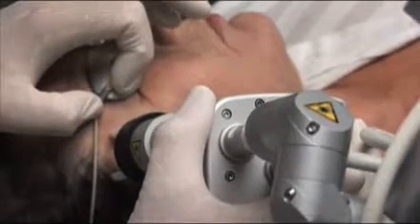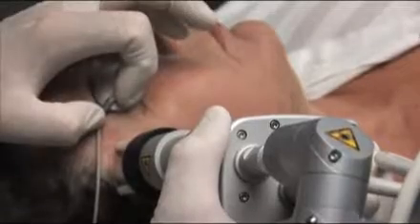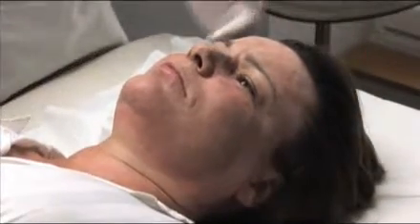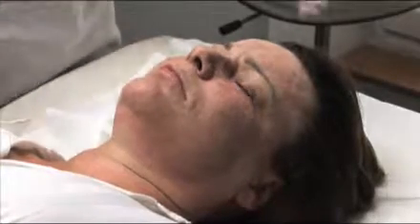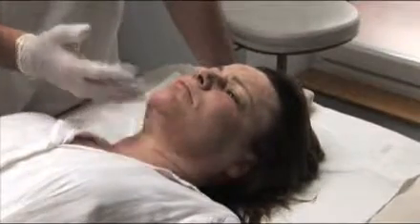And on the scalp, I go into the hairline to avoid any demarcation line. Intervention is finished. We can see the entire face has been treated and that the intervention area is limited to the area to be treated. We therefore treated the hairline, ears, close to the lashes, lower eyelid. We did not treat the upper eyelid as this was not necessary.